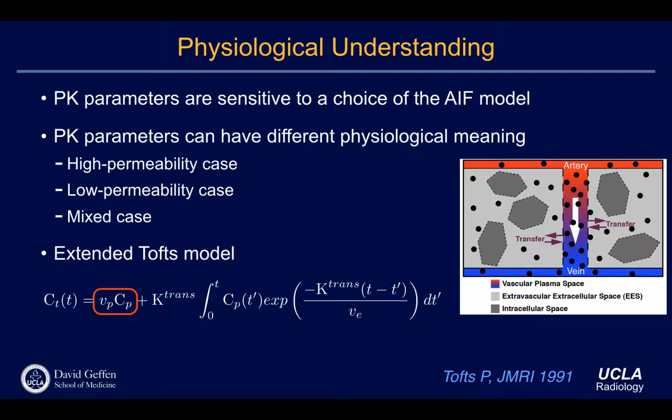Again, as I said, depending on the tissue status, K-trans is not really fully representing the perfusion or the flow. So it only kind of makes sense in a tumor. So sometimes you have to be very careful to try to understand what that means. So in many cases, my recommendation is don't try to map one-to-one. Sure, there is some representation, some showing of the flow information in the tumor, but in the meantime, the outside area is not purely showing perfusion. It's actually mixed cases, right? Unless you can completely separate those out, K-trans is just K-trans, right?